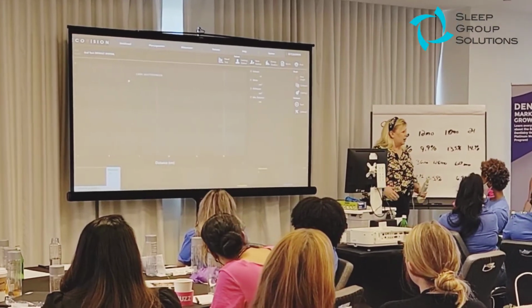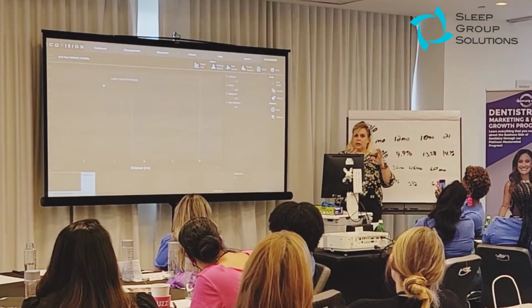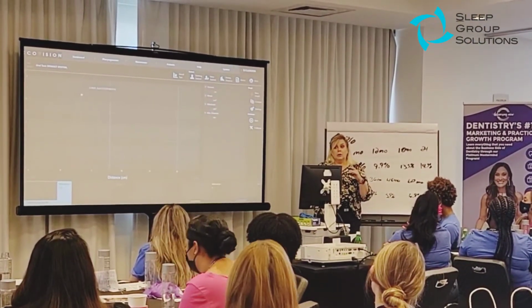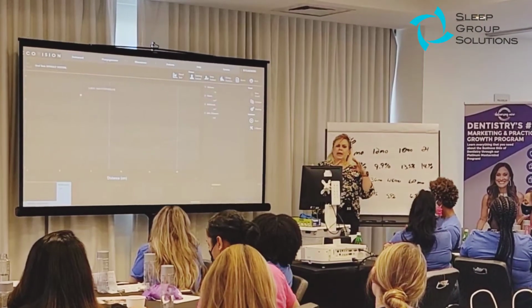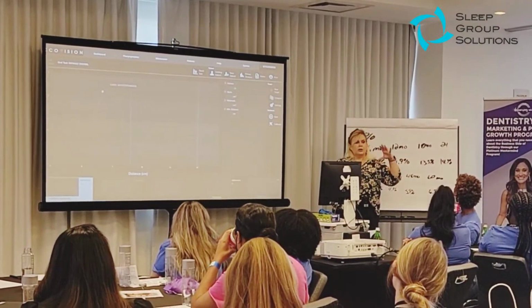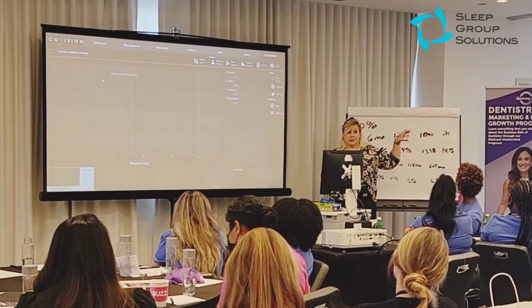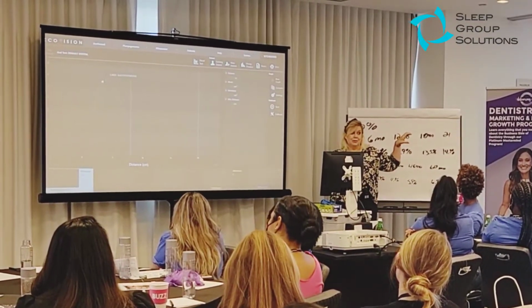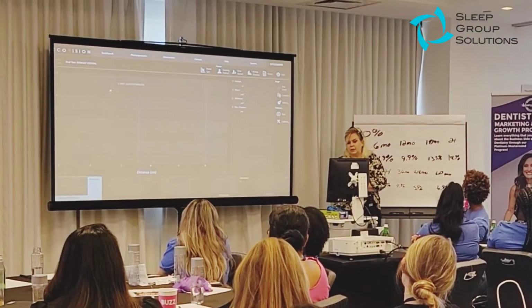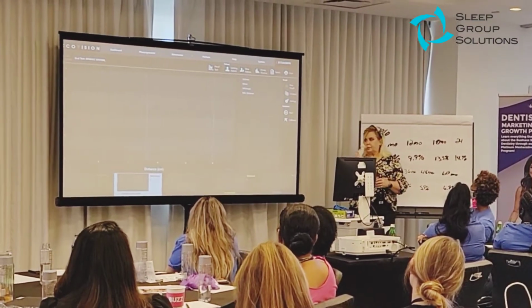But what happens when I go to sleep? You know, when we go to sleep and we relax, the muscles on the outside of the tube relax. But our breathing becomes much more shallow. So what happens if I would take the air out of this tube? If I breathe out and get the air out of this tube. If the tube's healthy, when I breathe out, it still looks like that tube. Unfortunately, if you don't, then that tube's going to follow the air out. So let's see what happens to my airway on exhale, okay?